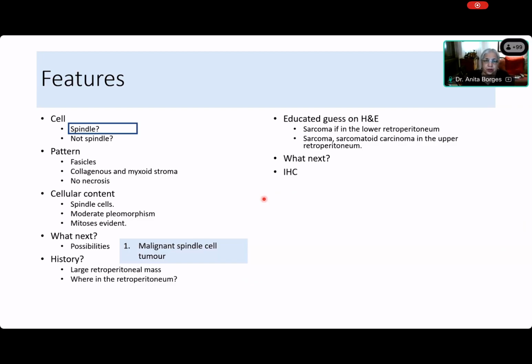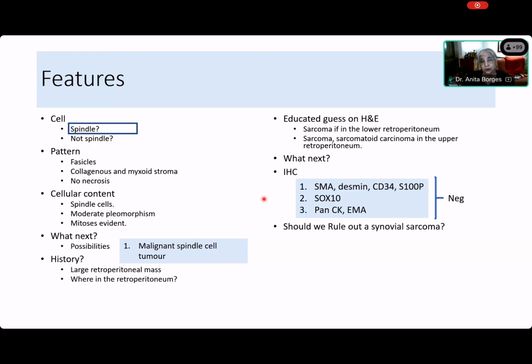Okay, so we have to do immunohistochemistry. So we do SMA, desmin, CD34, S100, SOX10, pan-CK, EMA, and they were all negative. Okay, so they're negative. Now what do we do? Is there anything that we can do? Should we rule out a synovial sarcoma? There's no necrosis. There are very few mitoses. And the answer is no. This is pleomorphic. It can never be a synovial sarcoma. No, synovial sarcomas are never pleomorphic, necrotic, or mitotically active. So that's not a synovial sarcoma.